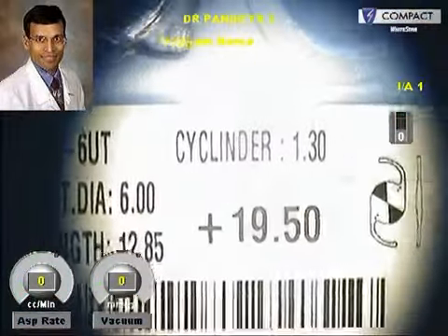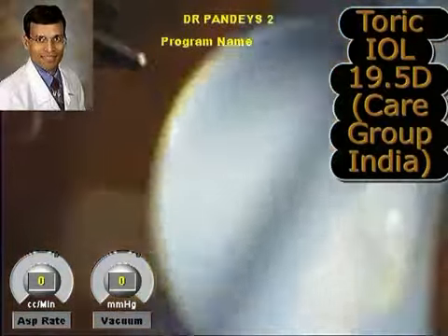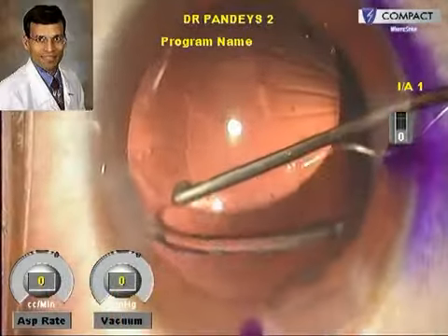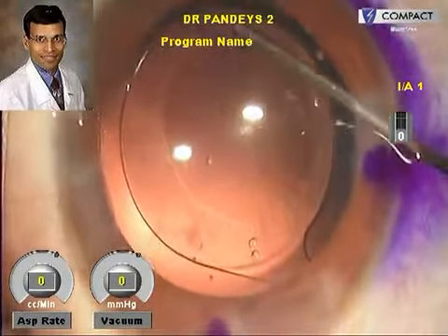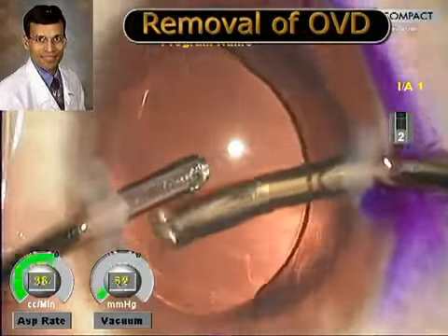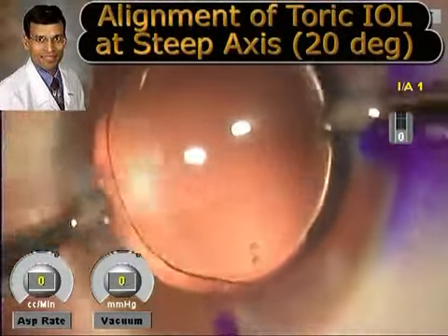This is a plus 19.5 diopter toric IOL available from Care Group India, which is being implanted in the capsular bag. The toric IOL is then dialed into place achieving proper positioning along the astigmatic axis. Finally, the viscoelastic is removed from under the IOL and the final positioning of the IOL is checked to align with the astigmatic axis.